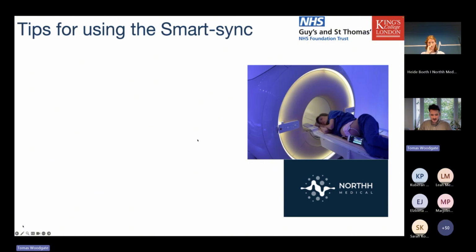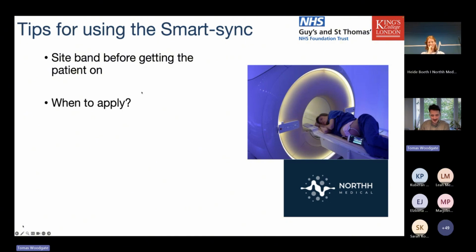Also, let's talk about some tips from using things like the SmartSync in clinical practice. A main thing I would say is definitely you want to try and site the band before getting the patient on. Sometimes we forget to do this, and it's just much slicker if you've got the band there before the patient's on the table, so you don't have to feed it underneath them.